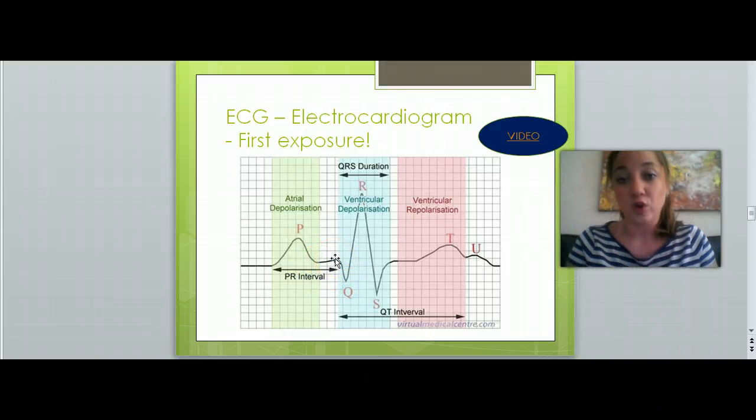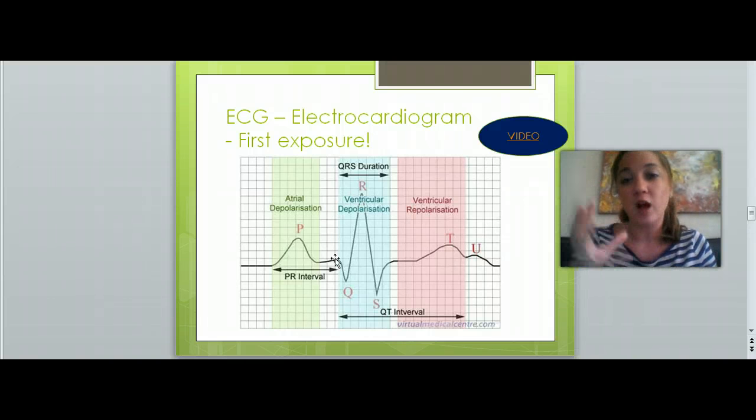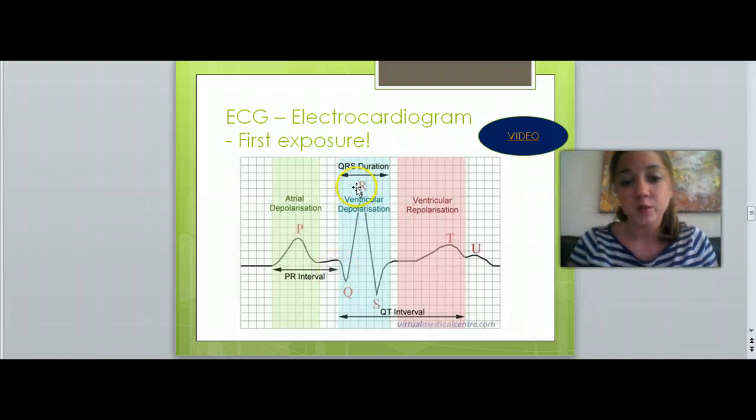So after that happens, the ventricles then need to depolarize because they've filled with the blood. That electrical impulse has spread to those ventricles. They need to get rid of that blood. They have got to push it out. Okay, so what we see there, and remember when we were looking at the picture of the ventricles, they have a lot thicker and more of the myocardium surrounding the ventricles, so they have a lot more ability to push and force through that blood. So that's what we're seeing in this mountain peak here. We're calling it ventricular depolarization, but it's also what happens during ventricular systole.